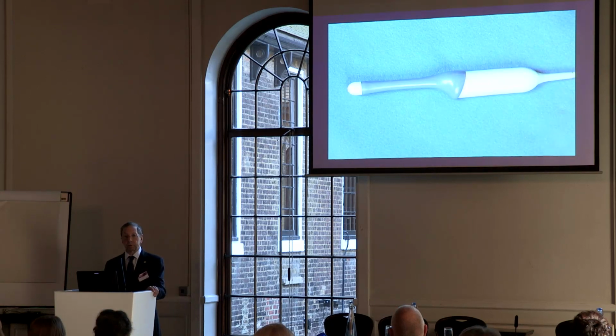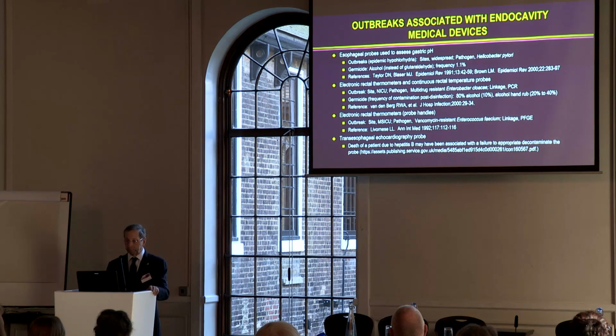This, of course, is just a picture of a probe. These are more and more widely used for a variety of reasons, in particular, obviously, for searching for cancer, but in women, obviously, probes may be used for other medical problems.